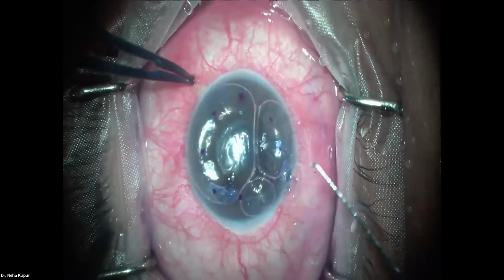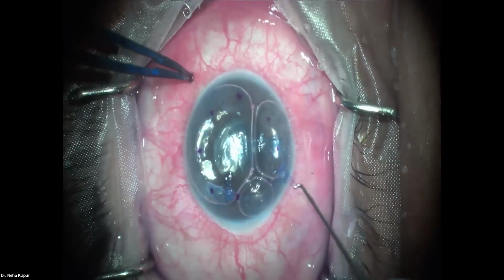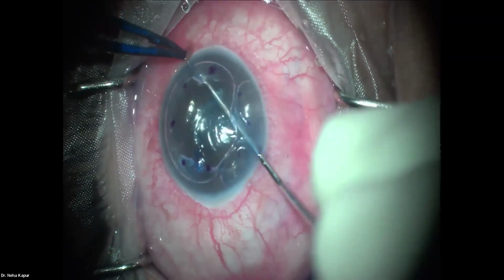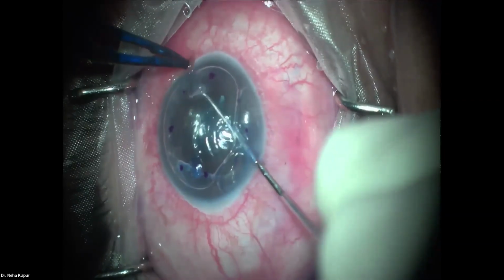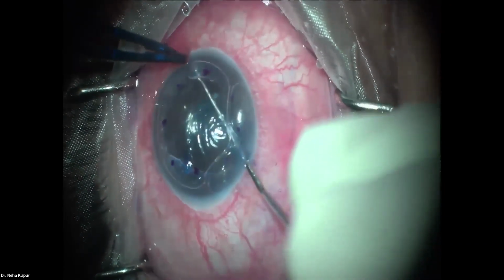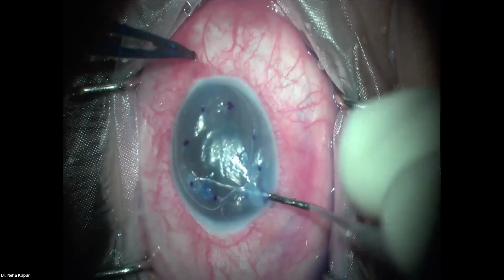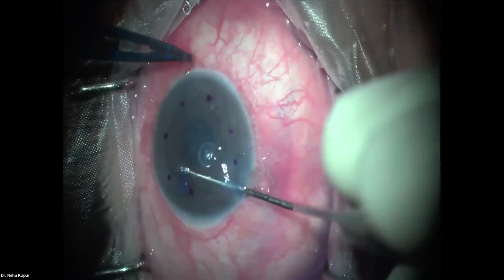So usually in a DSEK, it is, of course, important to get the DM out. But if you have some small tags of DM left, it's not a mandate to get each and every one of those tags out, unlike a DMEK, where it is mandatory to get those out because your thin membrane lenticule won't stick without those coming out. However, of course, it's best to get all of it out so that you have your lenticule sticking well in the eye.